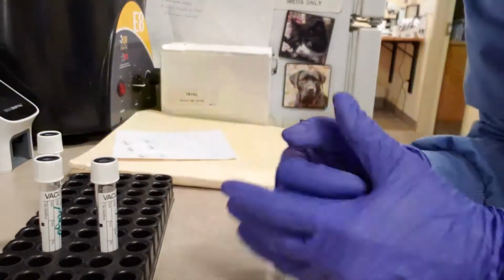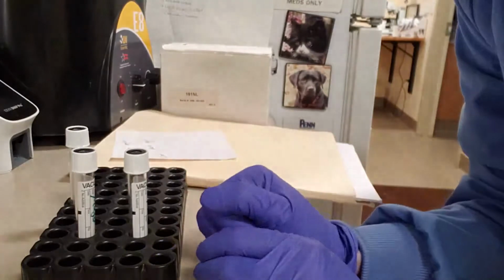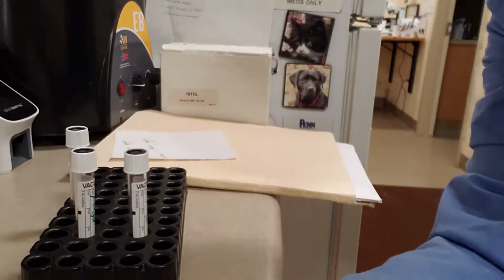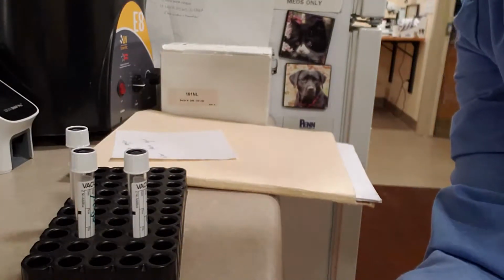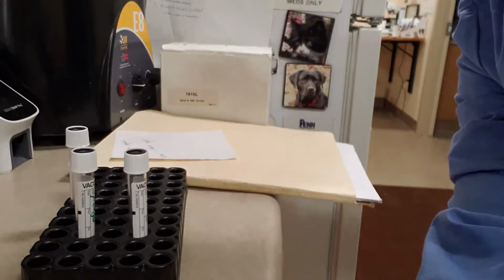And then finally, we have our control, which, as we would expect, doesn't really have any agglutination because it's from the same patient. So from here, we will add a drop of these to our slides and we will examine them microscopically over at the microscope.